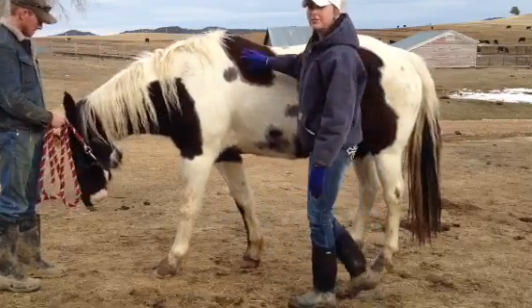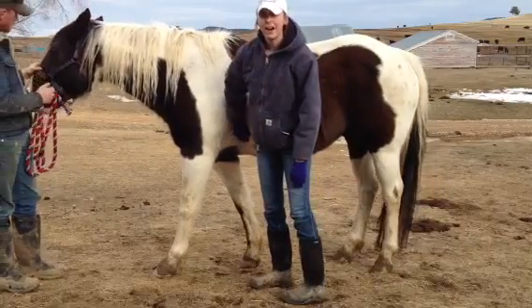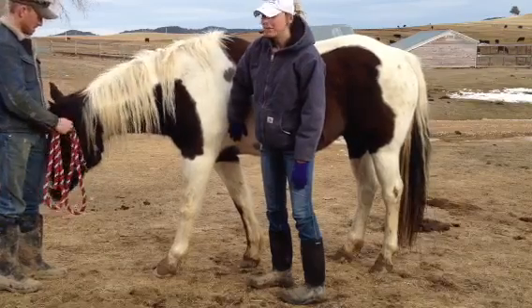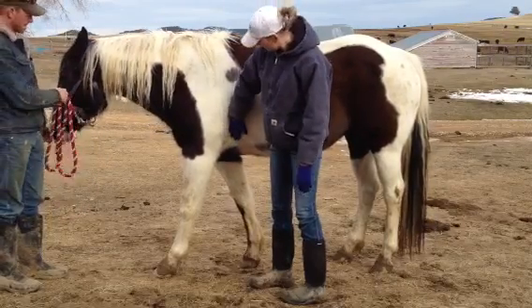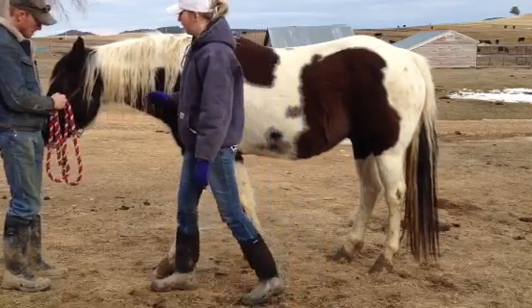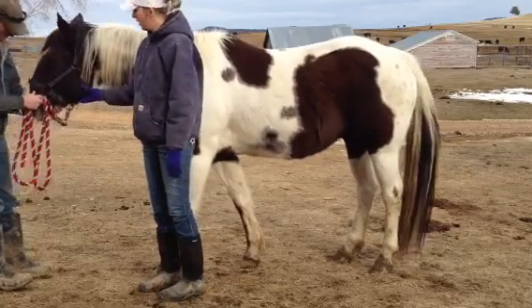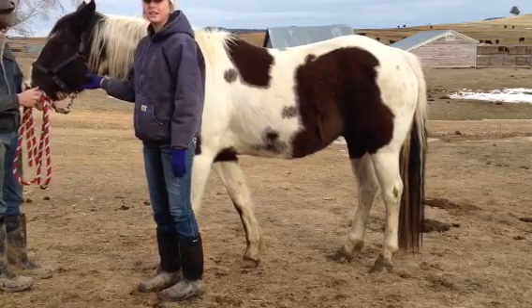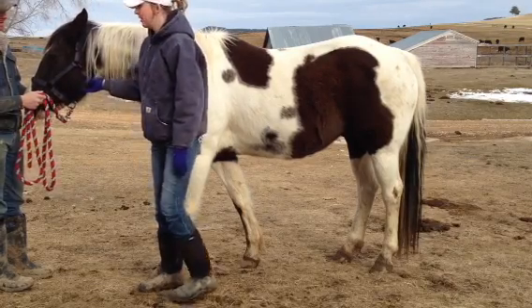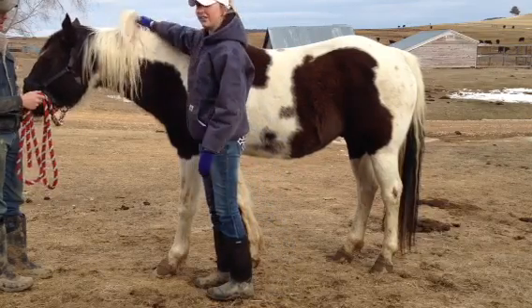The next vital is heart rate. You're going to want to take a stethoscope if you have one and put it behind their elbow and listen to their heart rate. You could also find the vein that's in their cheek and listen to or feel their heart rate that way too.